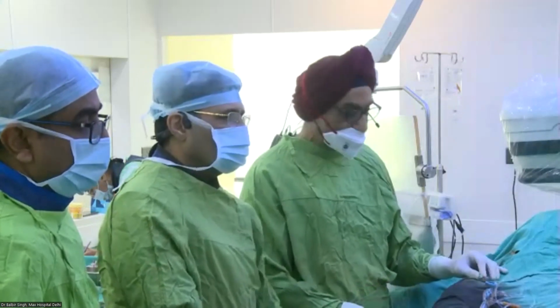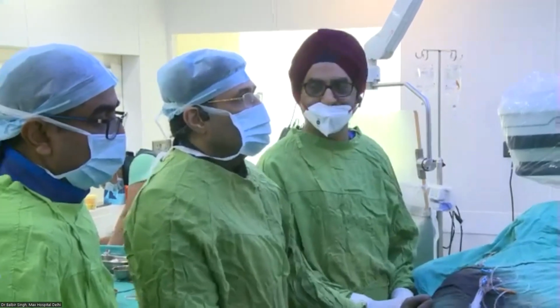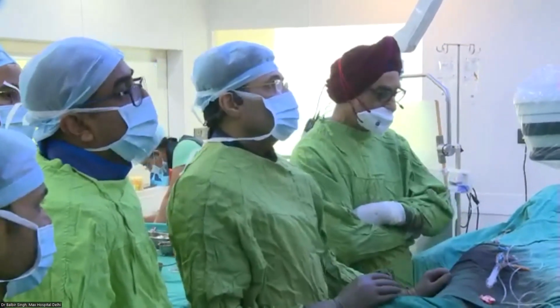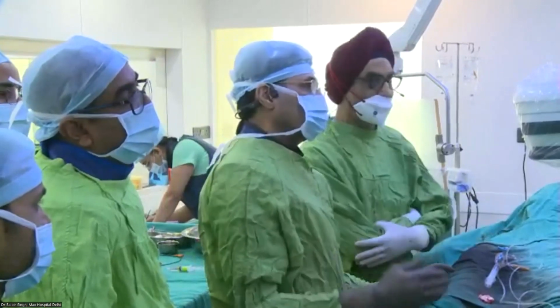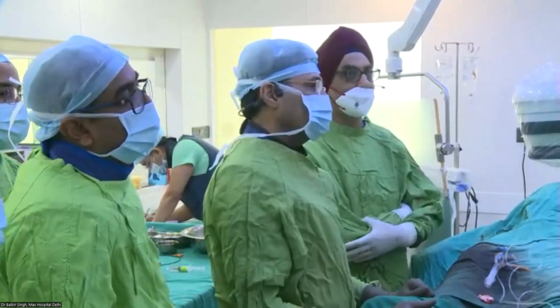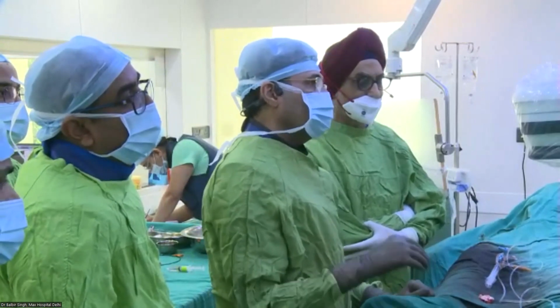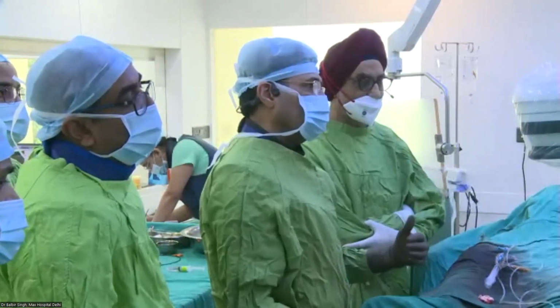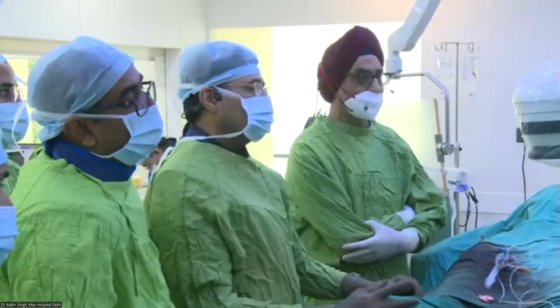Dr. Rathi is my colleague, so he's been through all the difficult steps with me. It was really challenging to recross the circ, and as you know, we had 3 layers of the stent at the ostium of the circ. And the important thing is, if your one wire is not crossing, not taking the balloon properly, always take another wire and try to recross. That's the crux. Exactly.